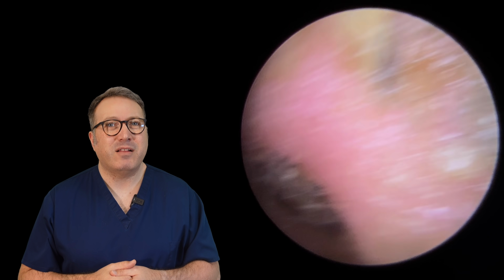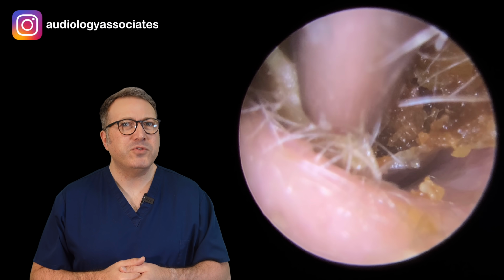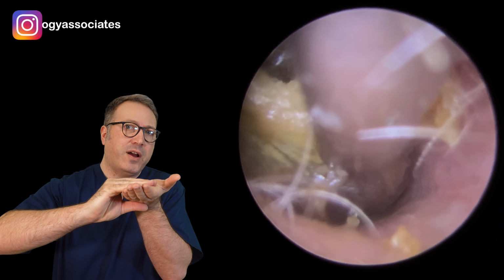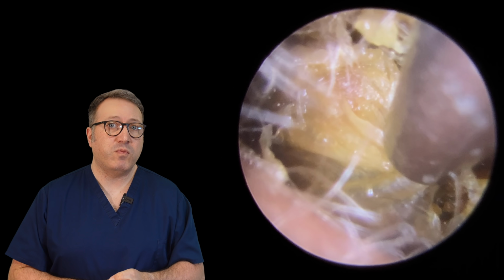I just missed that little bit of skin there, so I'm going to have to reposition this. What I'm doing is lifting up to give enough clearance to get the jaws of the forceps above, so we can get it above and below that piece of wax there. Obviously, if it starts to move when we do this, then we'll still carry on with the suction.